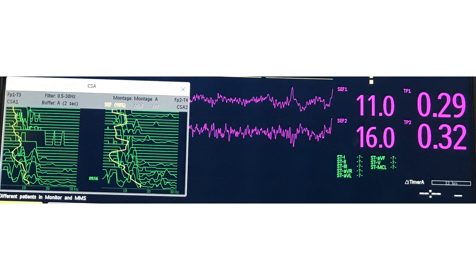Just as the SEF gives a number for frequency, you also get a number for power — that's called total power. You can see TP1 for the left-sided CSA and TP2 for the right-sided CSA. The values for total power in a patient who is awake and conscious are normally about 2, whereas in a deeply sedated patient, total power can be less than 0.1.